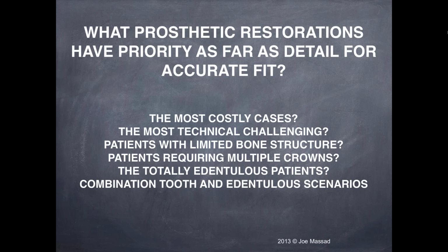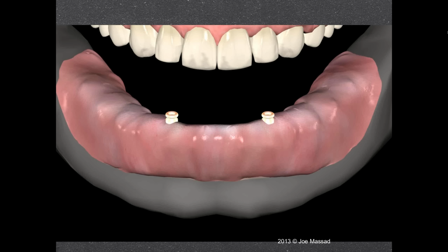Well, you know, we started out some years back in the 80s doing little overdentures. And for a while they were rather successful, and I think still have been. However, there were some speed bumps that we got into. Part of the speed bump was the prostheses would fit to an extent that they would rock a little bit. Maybe the tissue was taken dehydrated. Maybe we didn't have a great impression.